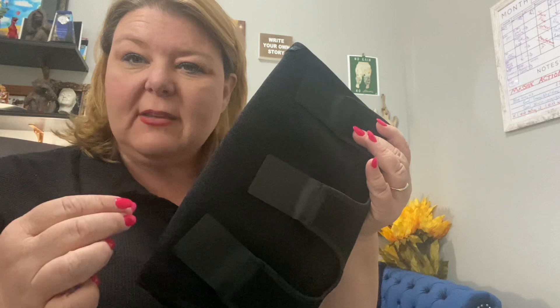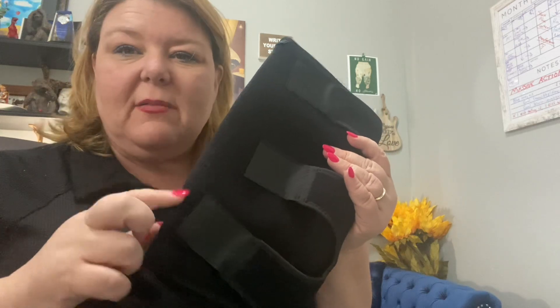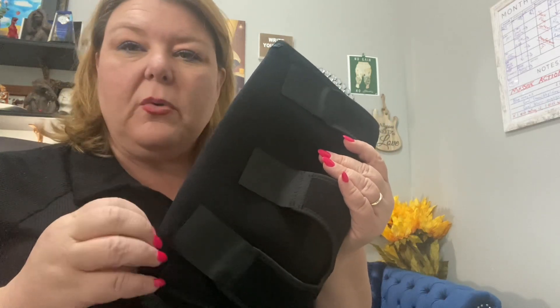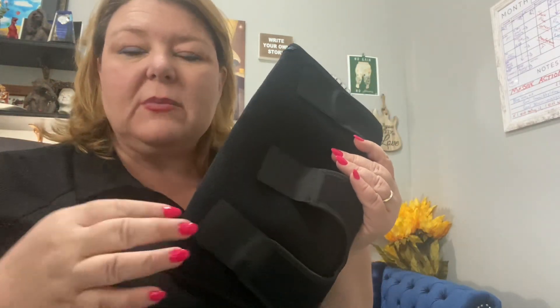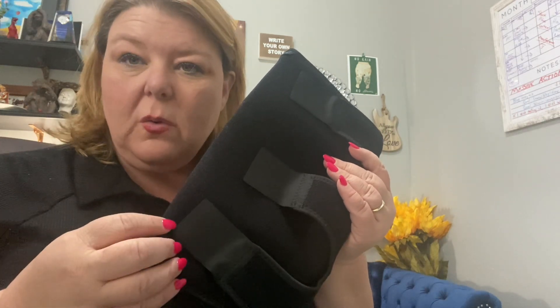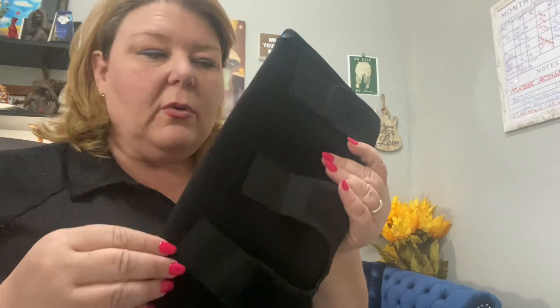This is not a decongestive device like what you would use with a Farrow wrap or items where you'd use these instead of bandaging. This is more of a support brace for if you're going to spend the day at Disney World or walking around the mall and you just need some extra support. It's probably not going to decongest you, but it will give you that little bit of extra support.